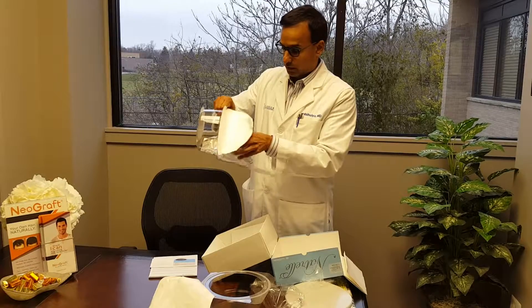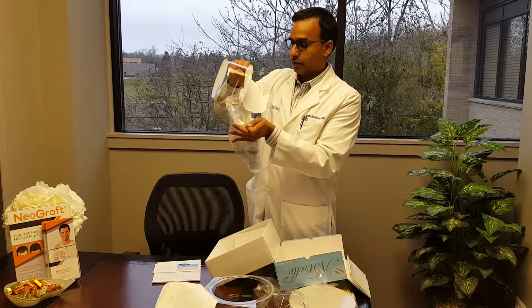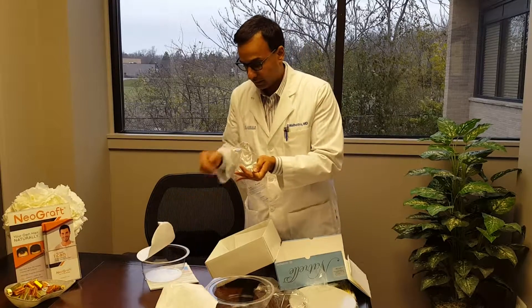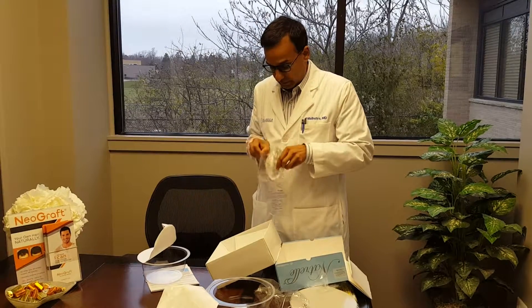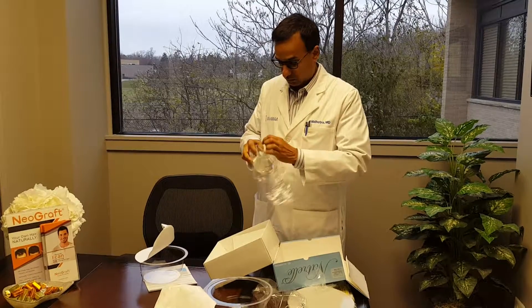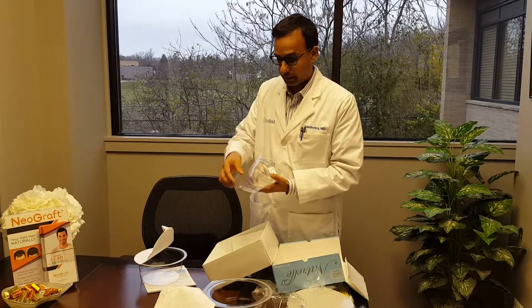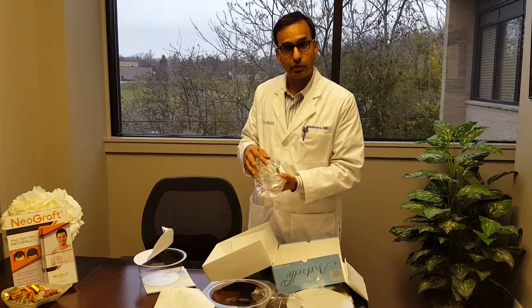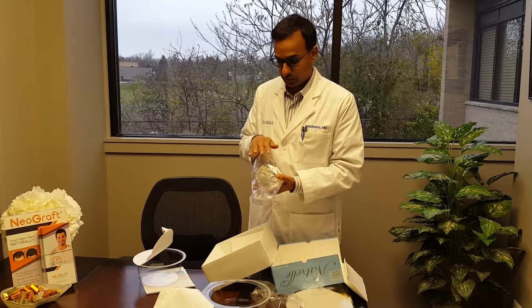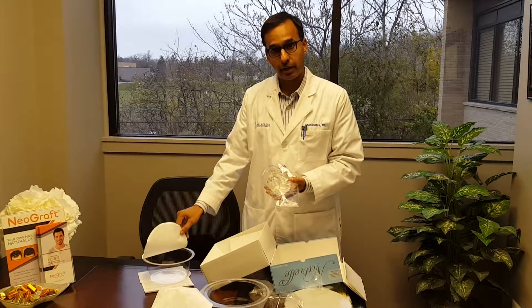Let's see if we can do it here — although it usually has to be lubricated for it to flow smoothly. Because it's not lubricated it won't go easily, but this just shows that we're able to squeeze the implant through a much smaller incision — about 25 percent smaller. So this shows the Keller funnel and just how a sterile silicone implant is packaged.